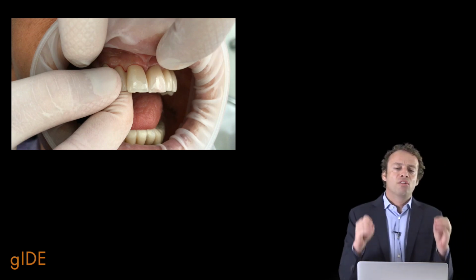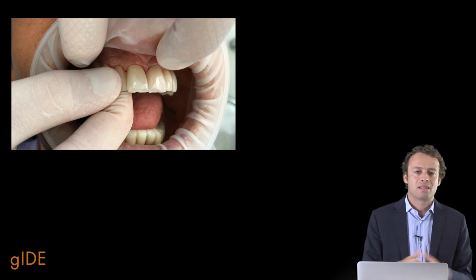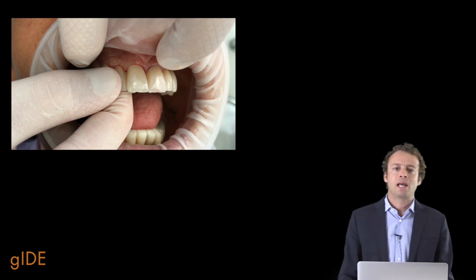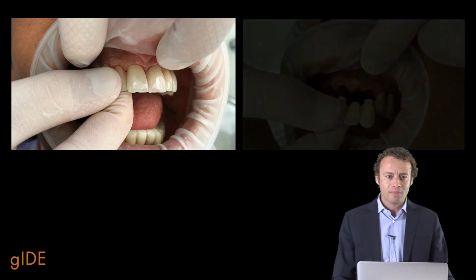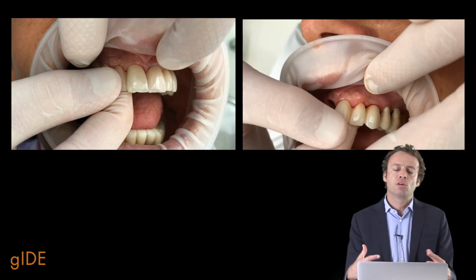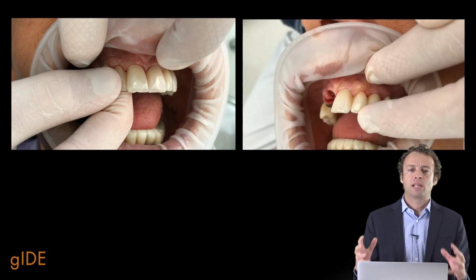So we spend 50 minutes to take a better impression, but we save at least 1 hour of time adjusting the final result, which really often, if we don't work with this kind of approach, is necessary in order to have a really good prosthetic outcome. And also on the opposite side we can see the same thing. The combination of the bridge with the soft tissues is really good. We have a perfect blending and we don't need any kind of adjustment.